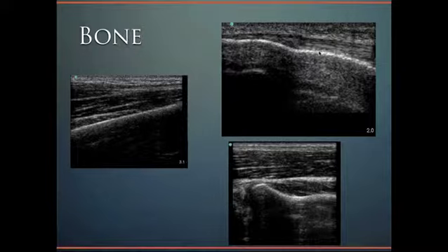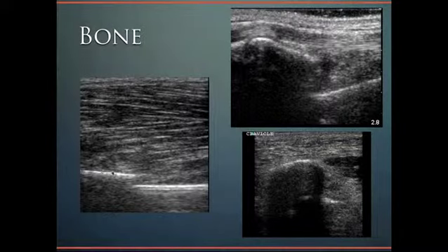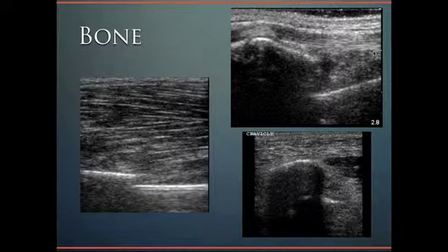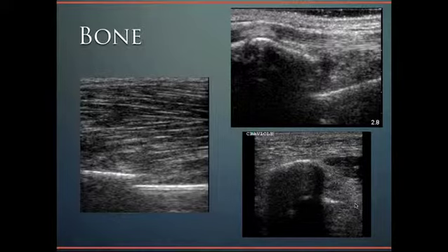We can see the bone and make it out along its long axis. When the bone has a fracture, we can see a step-off: one bony fragment, a step-off, and then another bony fragment. In this particular patient we can also make out anisotropy on the tendon, appearing falsely hypoechoic. With the clavicle fracture, one part of the clavicle is here, there's a step-off, and then another part of the clavicle is seen down there.